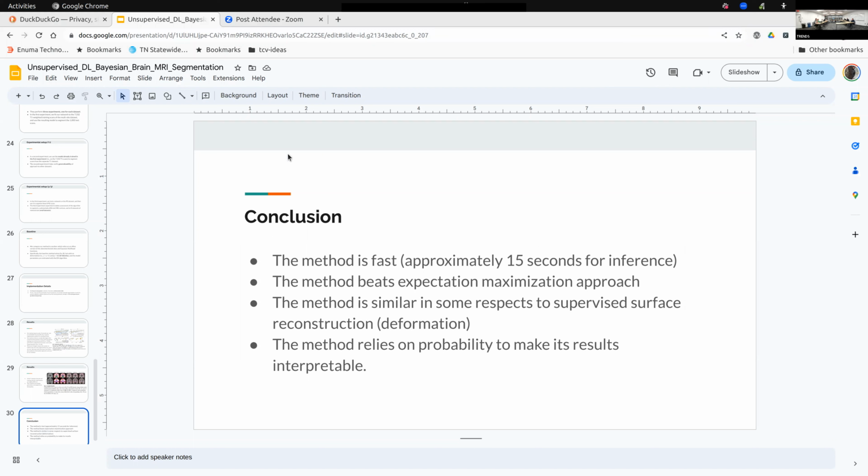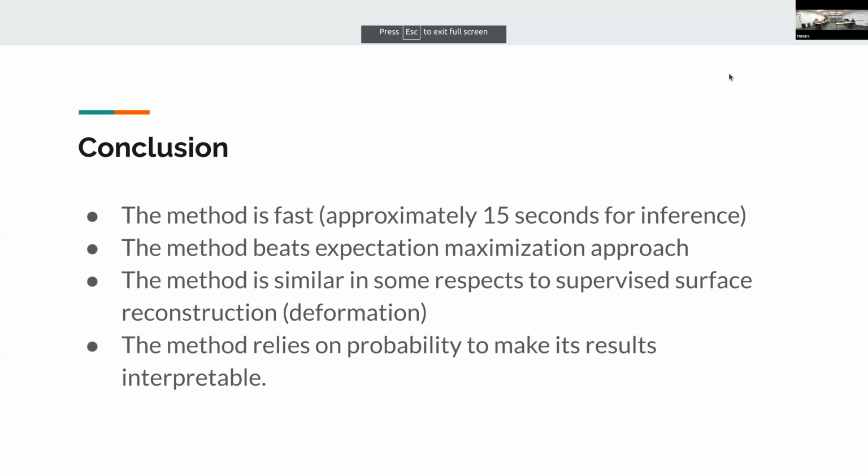That went too fast for me, but that's fine. If they can take an atlas, the thing you started with in the beginning, and deform it to the subject's brain, they're done, right? All the segmentation is there for each voxel. You could just deform an atlas and have a segmentation. Why aren't they stopping there? What comes after that?